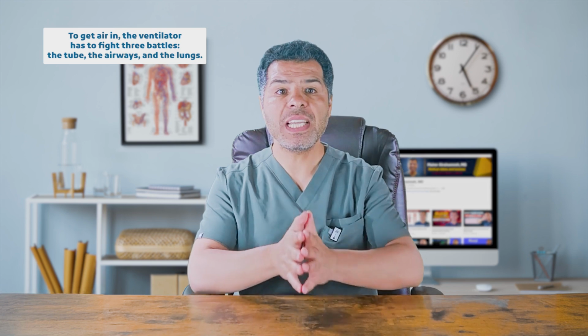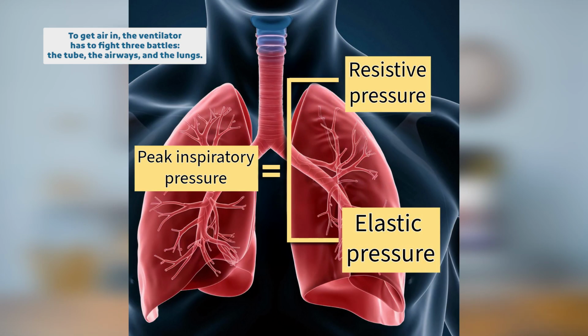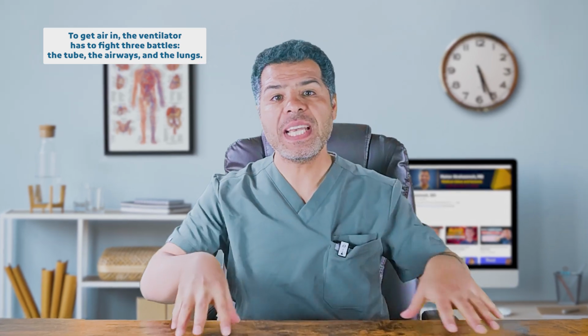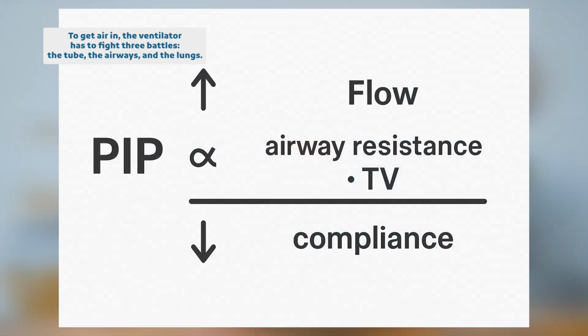In mechanical ventilation, the pressure required to deliver a breath is called the peak inspiratory pressure. Let's rewrite the equation again. Peak inspiratory pressure, PIP, equals resistive pressure plus elastic or alveolar pressure, which means the PIP equals flow times resistance plus tidal volume divided by compliance. So you can see here that peak inspiratory pressure is proportionally related to flow, airway resistance, and tidal volume, but inversely related to the compliance.